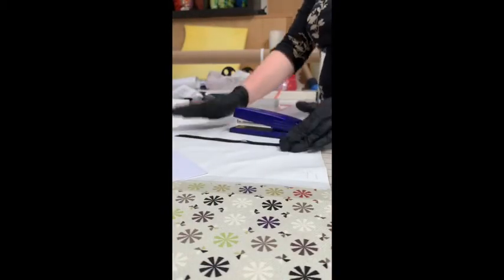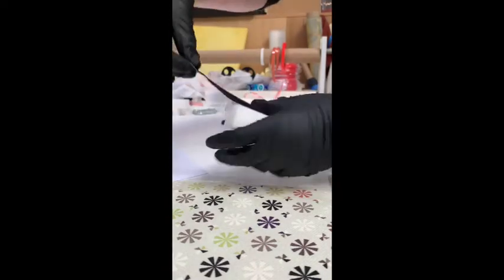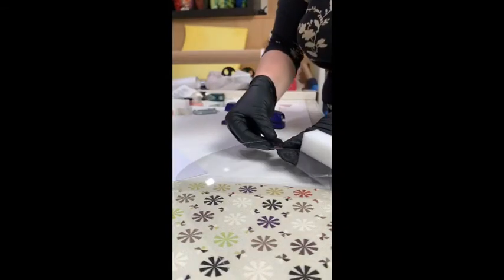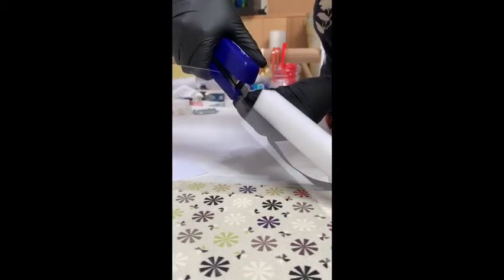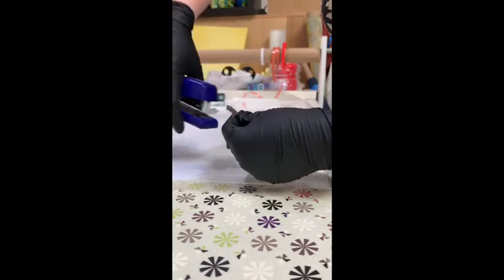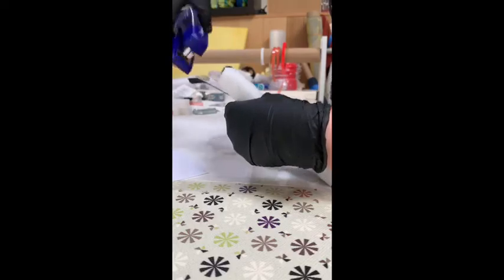down to the next person, who would have a stapler and a big pile of custom cut pieces of elastic. They would take that elastic and center it on the front shiny side to outside, and then flip it over so that they're stapling with the elastic on the bottom. That way we're avoiding some of the pieces of the staple catching their hair, and we're going to repeat that on the second side, making sure that it's centered, as well as with the elastic side down. And we're going to do 2 staples, one on the outside and one about half an inch in.